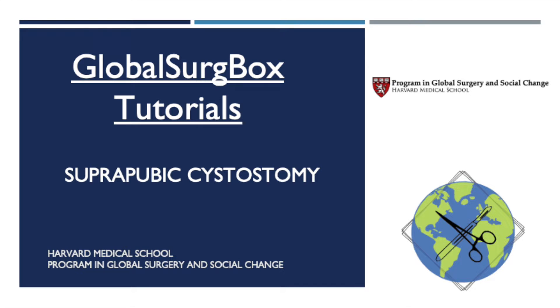In this video, we will simulate suprapubic cystostomy using the global surgery box. Suprapubic cystostomy is used when urethral catheterization is not feasible, primarily in cases of urethral stricture or obstruction, or in cases when direct irrigation of the bladder is required, such as for infusion of some chemotherapeutic agents.